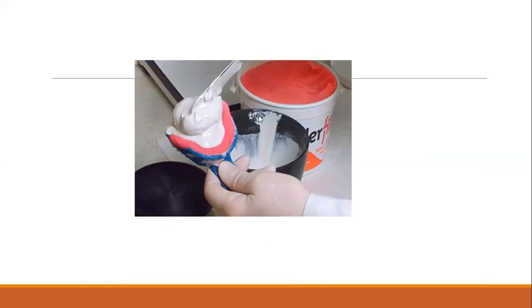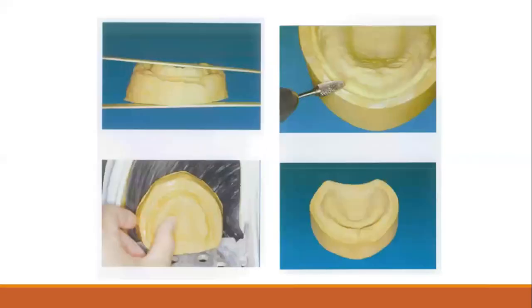I have to pour the impression, the primary impression, with the plaster. كيف بنسميه plaster of Paris لونه ابيض. I pour the impression لانه انا ما بدي قوه وصلابه عاليه. That's why I don't use stone. I use plaster. I pour the impression, I formulate my cast.